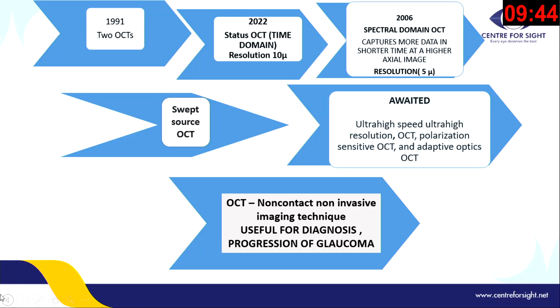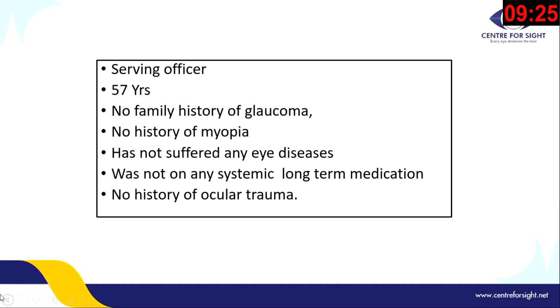So we've come a long way from 1991, where we didn't even see the first two OCTs, and now we have come down to swept source OCTs, and we are awaiting a lot more into our armamentarium. It's a non-contact, non-invasive imaging technique. It's very useful for diagnosis, prognosis, progression, and many other things which I'm going to talk about.